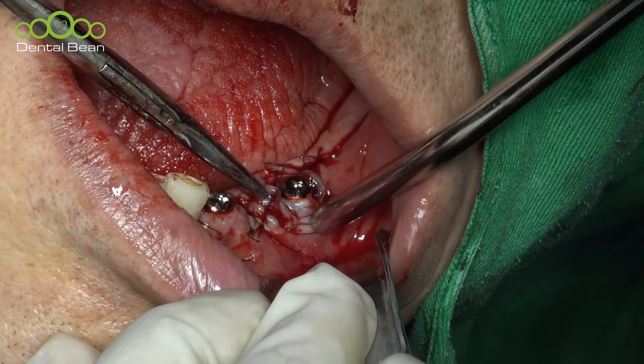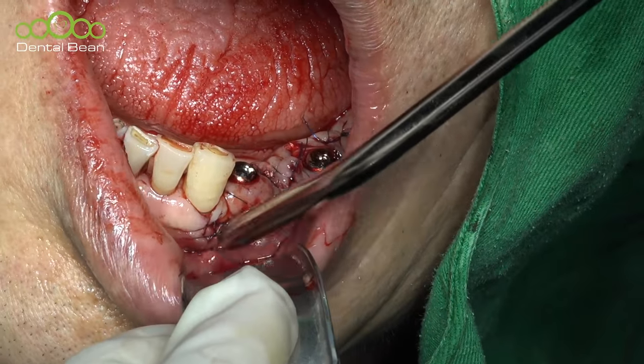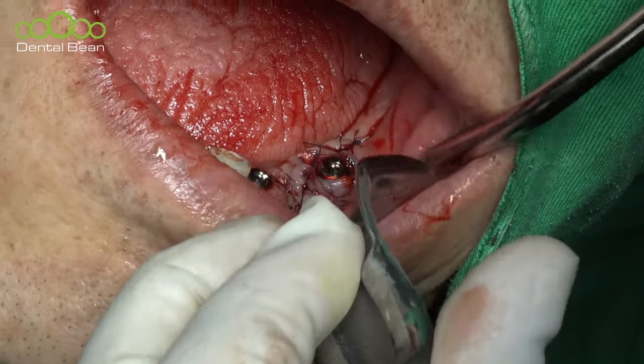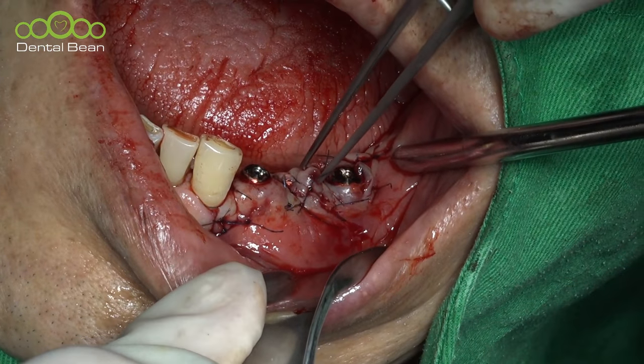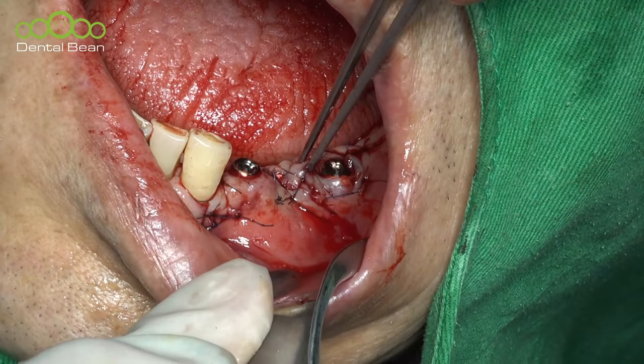I don't like this one. I don't like it. One more suture. With this one, without this one, at the time of second surgery, the result is different here. So like here, just the cutting here. Number 15.